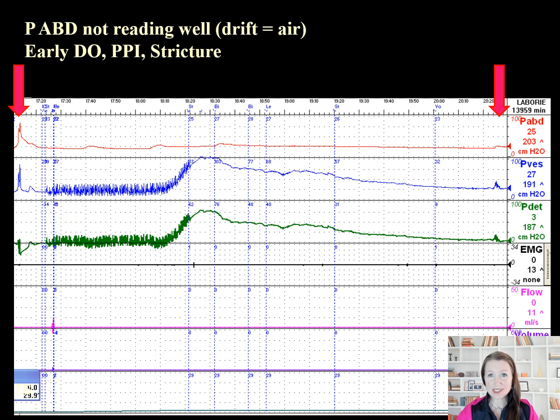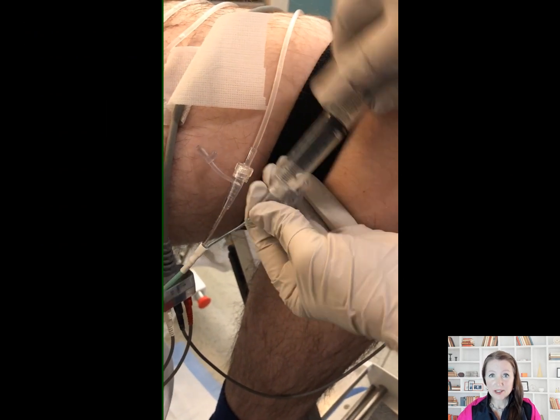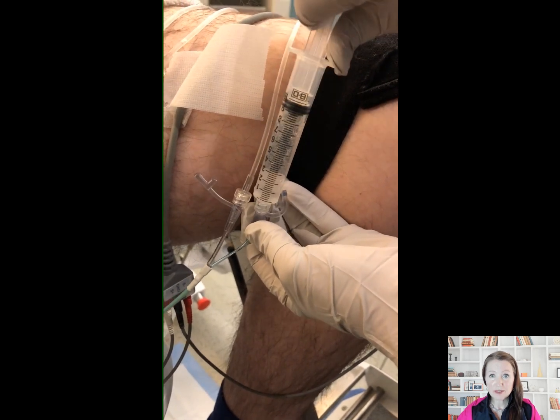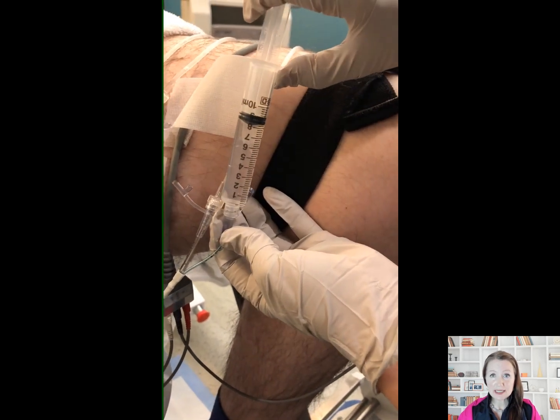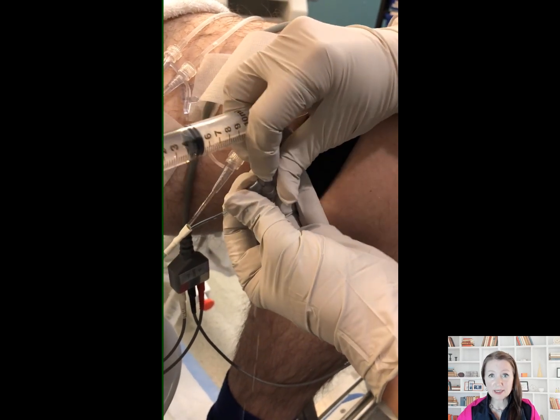In the beginning of the slide, you can see an altered slope of the rectal pressure with cough versus the P-Vest. This implies air is in the line. Unfortunately, this study was run without correcting and the artifact impacts the quality of the study throughout. Note also the study was performed through a Foley with a three-way stopcock, as evidenced by the fuzzy line during filling. Here we will evacuate air from the rectal catheter: attach a luer lock to each port, withdraw the air, and refill with approximately 3 cc's, as some will be lost during reconnection. A three-way stopcock can make this particular adjustment easier.